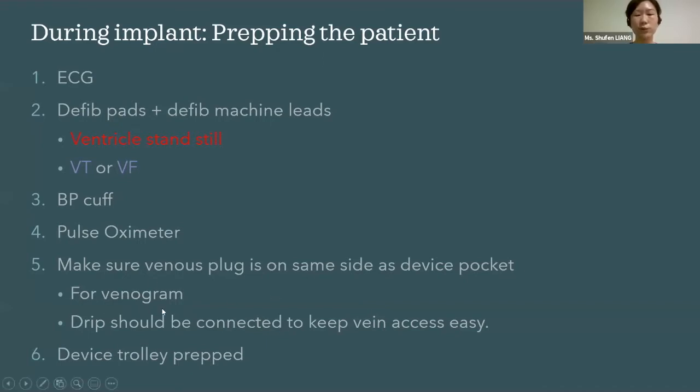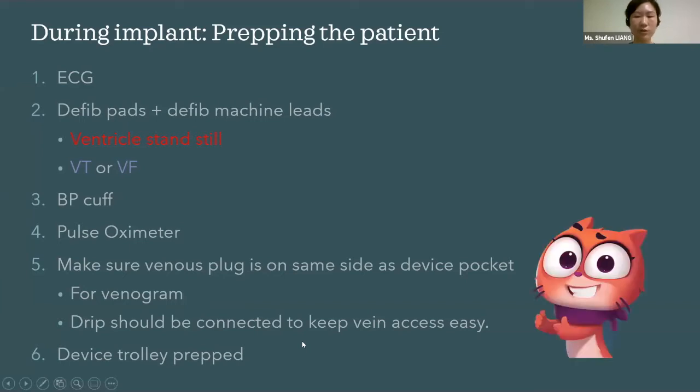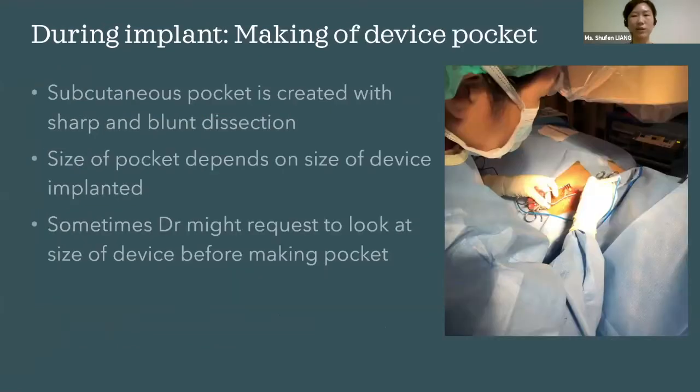So this would make it easier for the doctors to do venogram during the procedure and then to connect a drip so that the vein would be easy to access. And of course, we have our device trolley prepped already, so we can continue with the case.